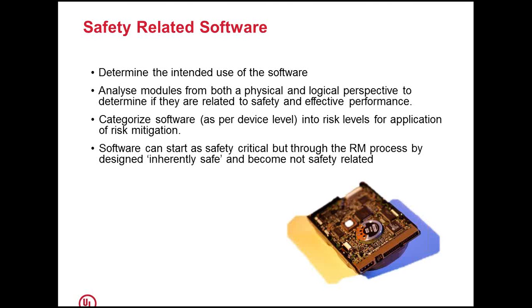Based on this determination, you need to analyze the software from a physical and a logical perspective to determine if they are related to safety and effective performance. Physical again involves the hardware, and that's where the physical attributes of a safe functioning of software come in.